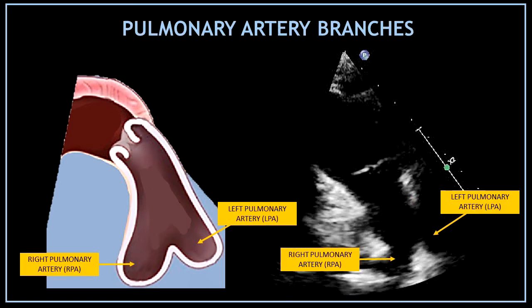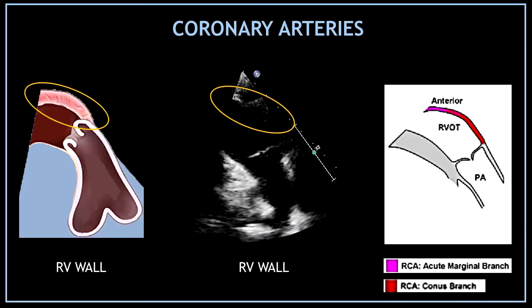Then the main pulmonary artery divides in two and we can find the pulmonary artery branches. On the left hand side you can see the right pulmonary artery, and on the right hand side you can see the left pulmonary artery. To finalize, in this view you can visualize a small segment of the right ventricular wall, where you can find the coronary arteries in charge of supplying blood to this segment.